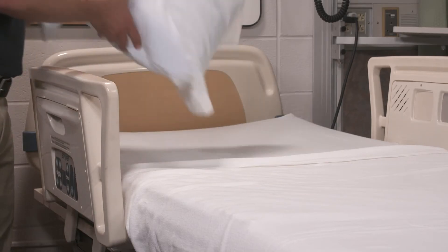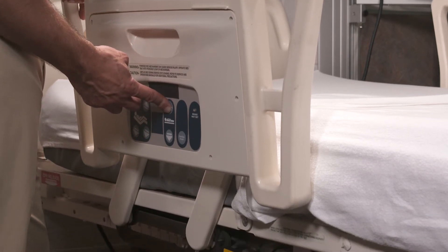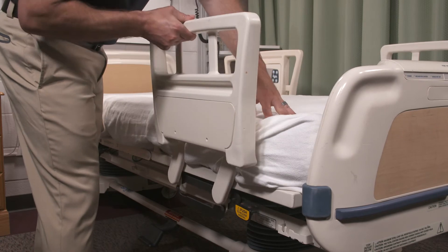Lock the wheels, remove all pillows and raise the bed to a comfortable working height, and keep the sheets in place. Make sure to fully raise all bed rails.